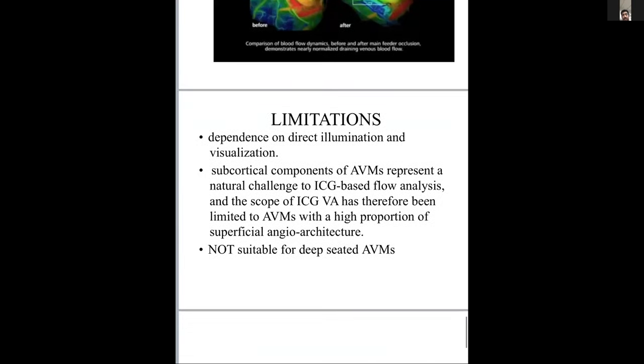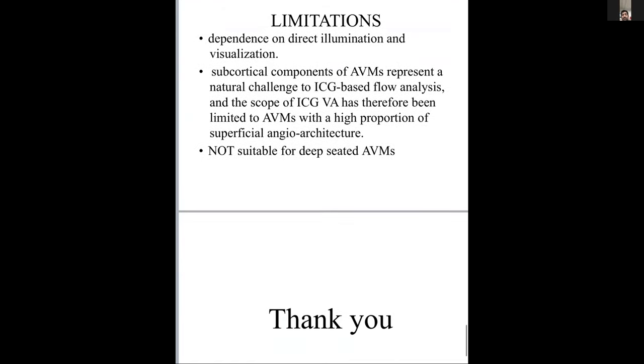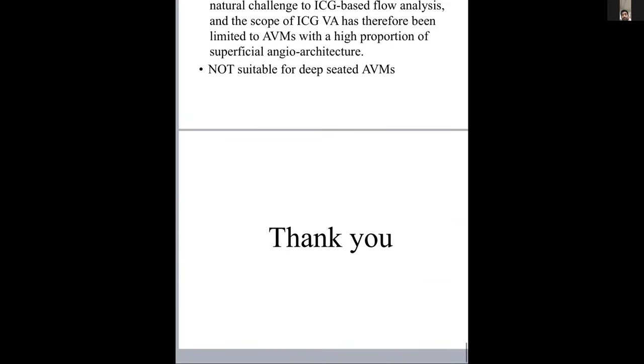But still, this software is not without limitations. Since it depends on direct illumination, subcortical components of AVM cannot be visualized, so it's not good for deep-seated AVM. Thank you.